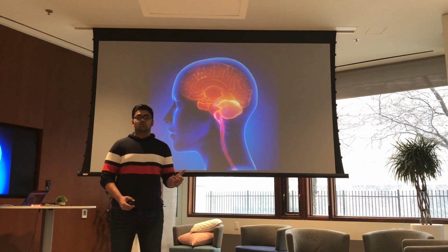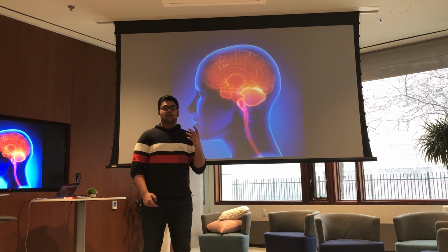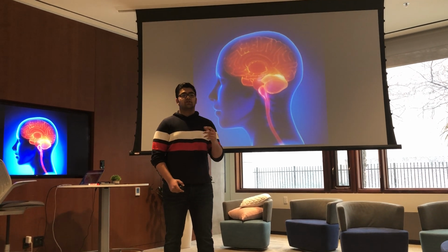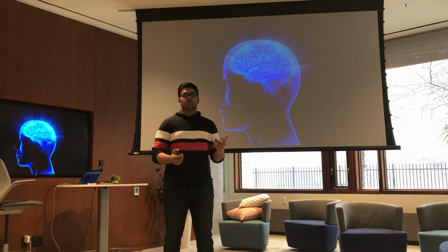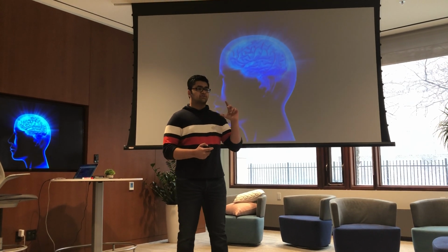My solution for this was to use EEG technology to make a brain-to-speech interface. Anytime you think of doing something or do anything, neurons in your head fire. When a single neuron fires, it's hard to measure, so we can't really access that information. But when groups of neurons fire at the same time, they produce large electric impulses that go through your skull and through your skin, and that we can now measure on the surface of your scalp using electrodes.